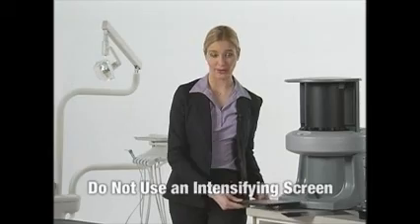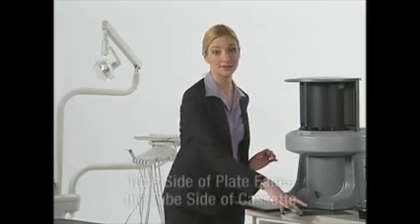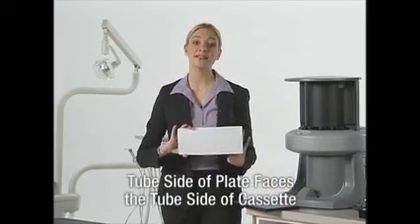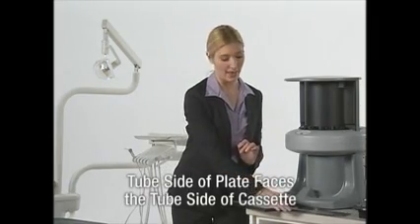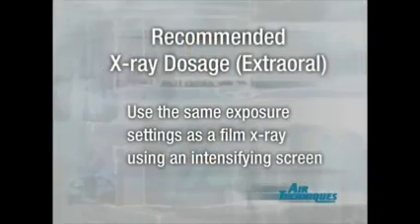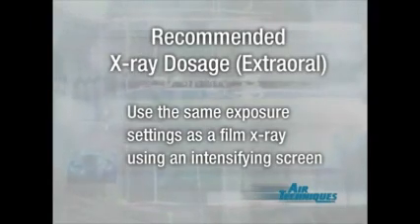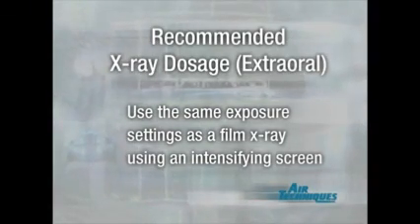As we did with the intra-oral plates, the tube side, the blank side of the plate, faces the tube side of the cassette. Since the plate doesn't go into the mouth, there's no barrier envelope. Load the cassette into your x-ray unit as you would for film and start using the same exposure settings as if you were making a film x-ray using an intensifying screen.